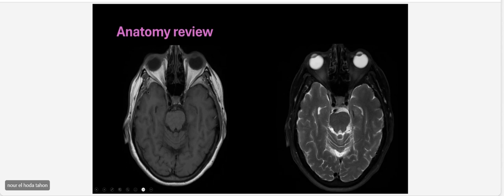And again here, we have part of the brain start to appear. This is the temporal pole, it's a temporal lobe, all of this, and this anterior part we named as a temporal pole. And this is also part of the ventricles and CSF that we can see bilaterally. And this is also something I want to show you and focus on because it's important for us during tumors. When you assess a tumor, you have to look at every single space, like ventricles.